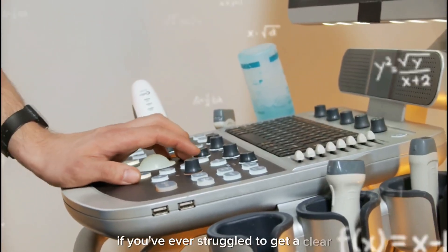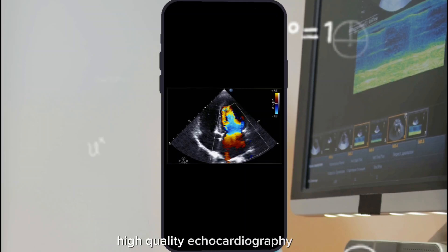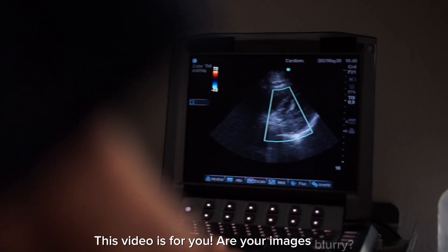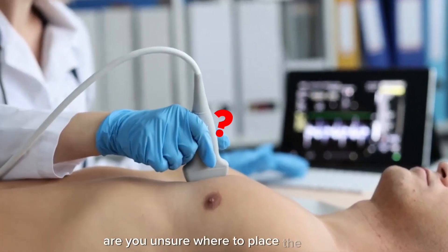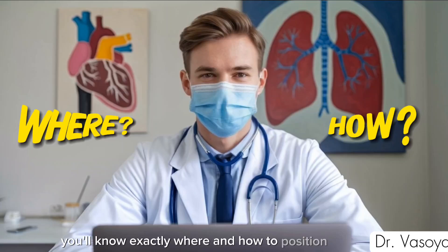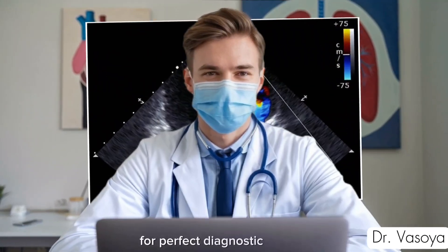If you've ever struggled to get a clear, high-quality echocardiography image, this video is for you. Are your images blurry? Are you unsure where to place the probe? Don't worry. By the end of this video, you'll know exactly where and how to position the probe for perfect diagnostic images every time. Let's get started.